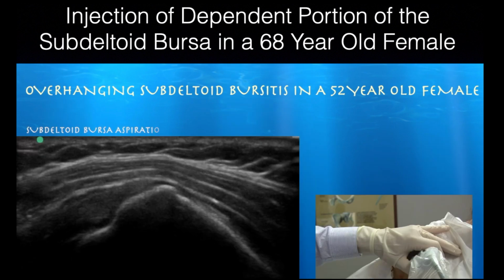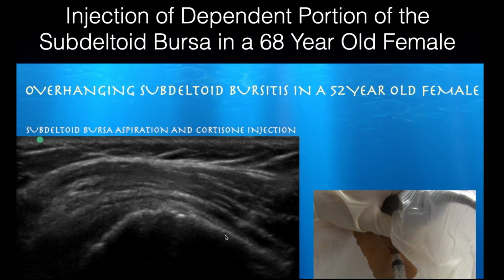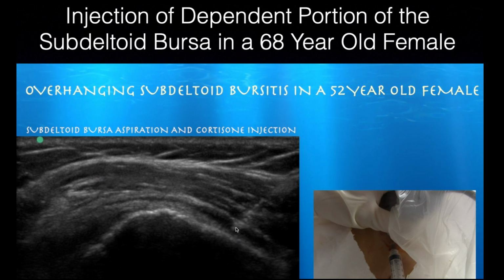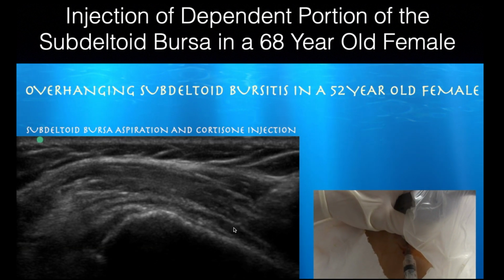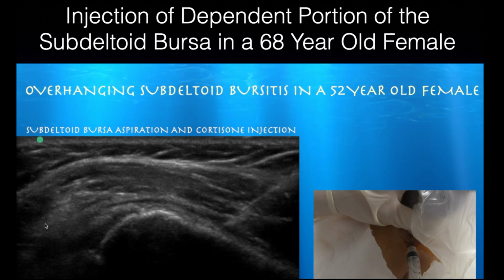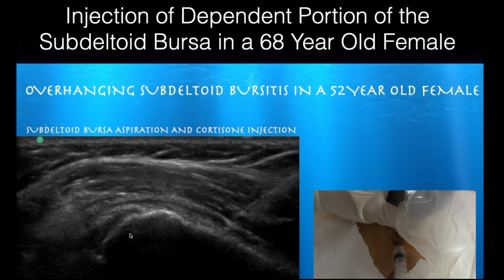But you can still do it, but then again, much of your injectate may just congregate here in this dependent portion from gravity and whatnot, cortisone or some sort of biologic. And again, you want your injectate to go over the tendon. So, I probably would not recommend this.